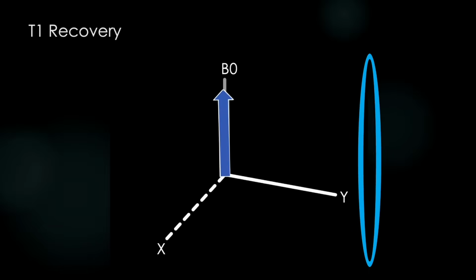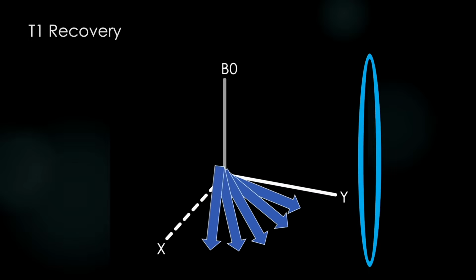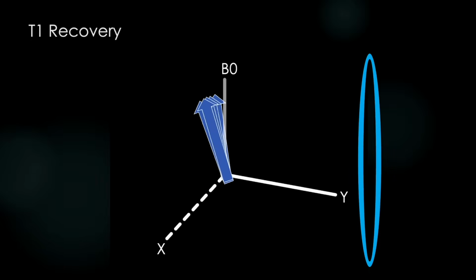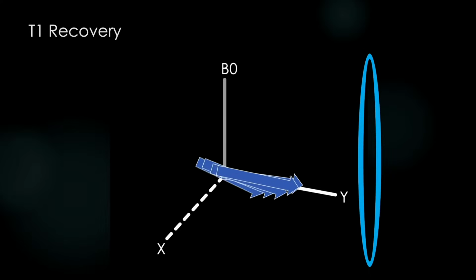Having trouble? So did I. There's something off here, right? I stared at this for days, maybe weeks, and could not get physically what's going on here in the most famous of MRI animations. Why would these rephase at a maximum parallel to the z-axis, where our coils see no signal at all?